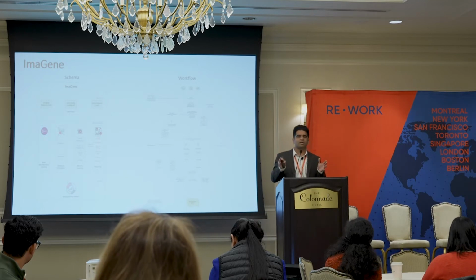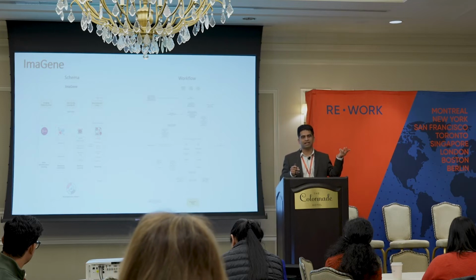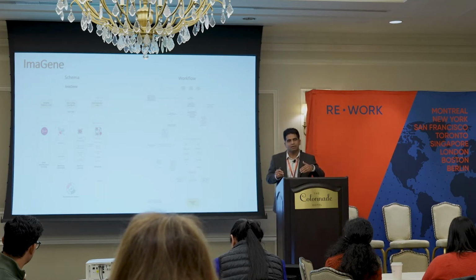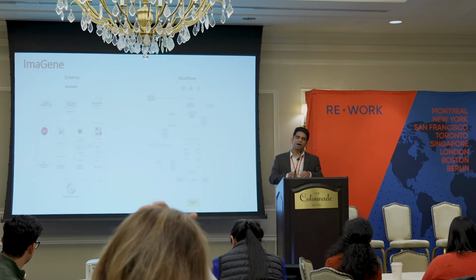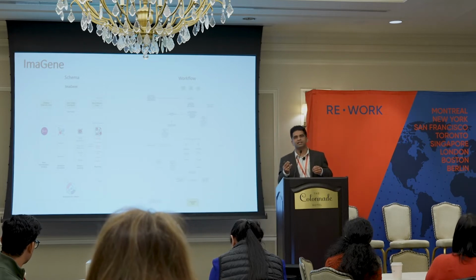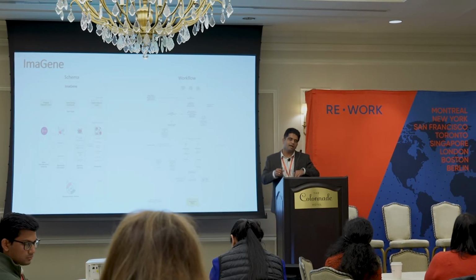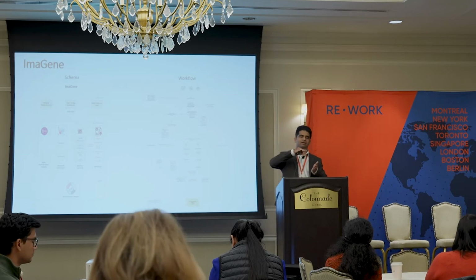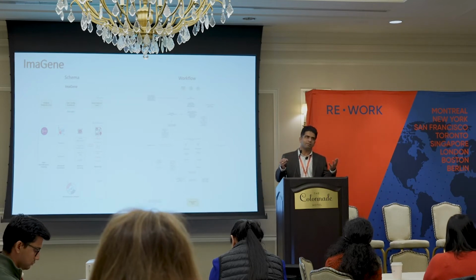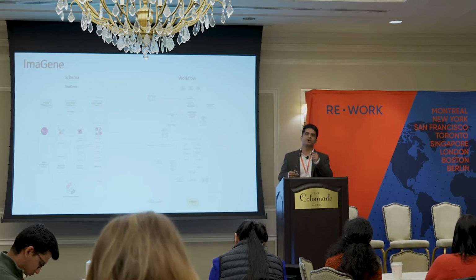And this software operates in two modes. The first mode does the correlations and the machine learning module, which does the modeling with or without the correlations. And the second part is the feature importance module, which does the machine learning modeling and spits out feature importance, feeds back the importance matrices for these features, and just select the features that could be retrained on the model.